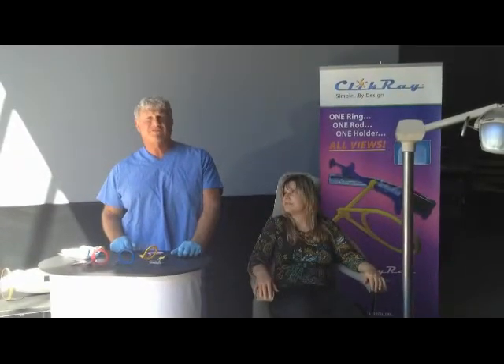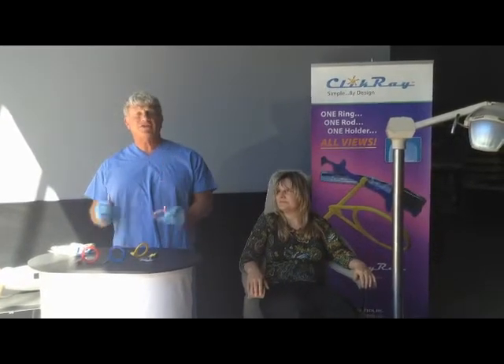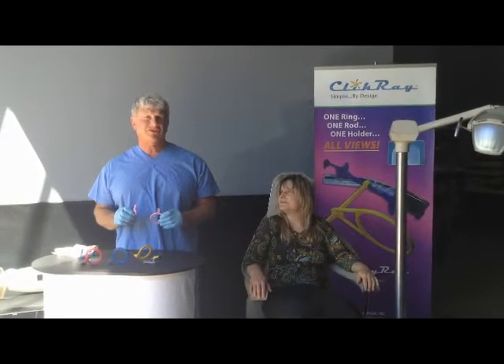Hi, I'm Dr. Harold Schmoltz and I'm here today to demonstrate the click stick system for taking radiographs. The click stick system is the single ring, single rod, single holder system to comfortably take a complete series of radiographs on your patients.